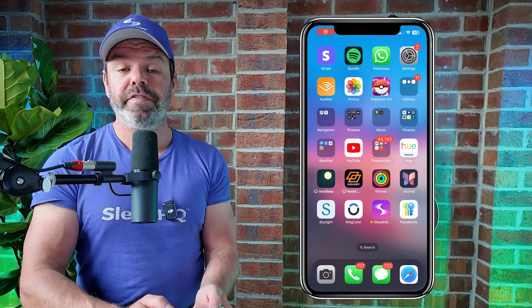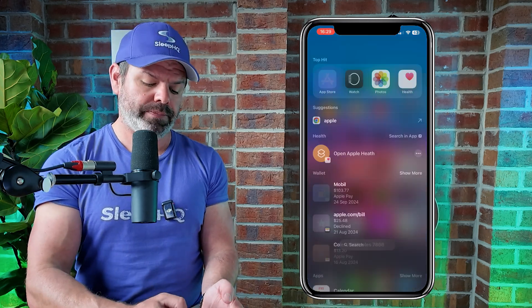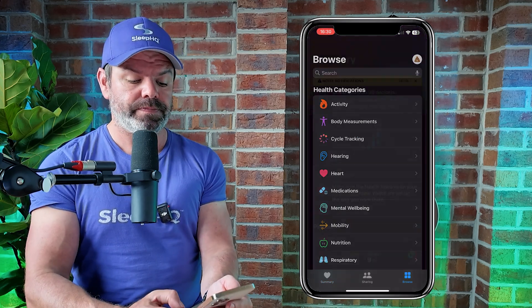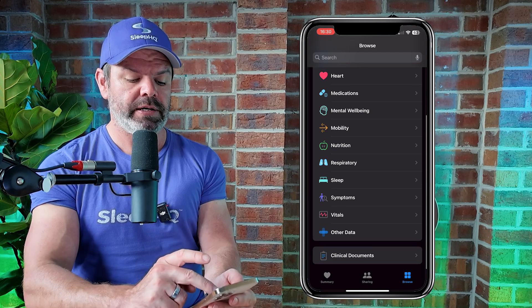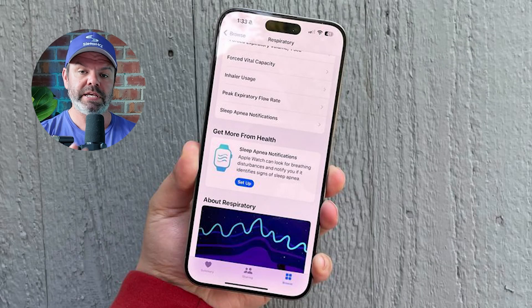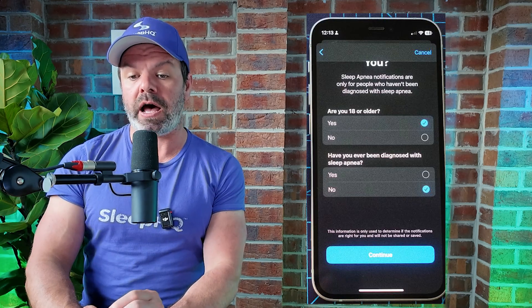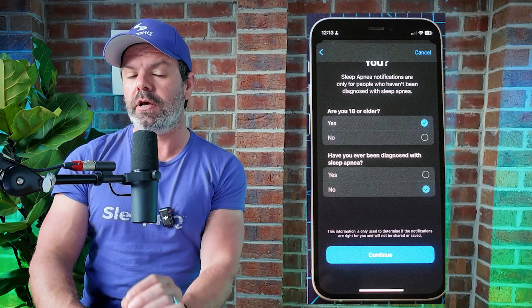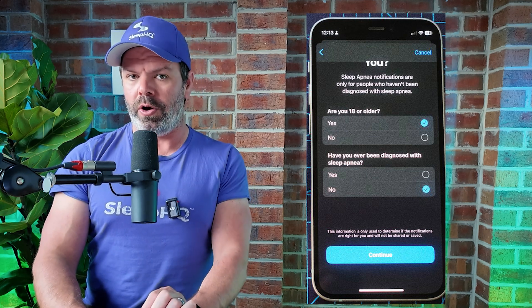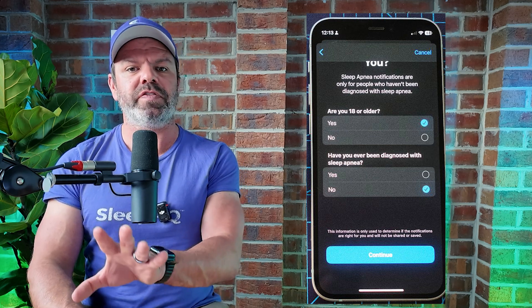If you've got all that, you can now turn on sleep apnea notifications. The first step is to navigate to the Apple Health app. Down the bottom right, click Browse, then find the Respiratory category — here it is with the lungs icon. Scroll down and you'll see a section that says 'Sleep Apnea Notifications.' Click Setup, then Next, and it will take you to another screen with two very important questions.